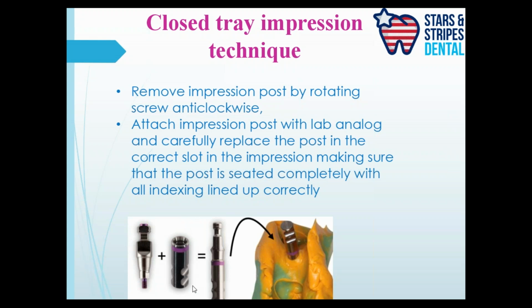Now, as the name suggests, why? First of all, understand what is implant analog. It is also known as implant replica. That means the implant you have placed in the patient's mouth, the same implant, an exact copy of that same implant, the Xerox copy of the same implant, is called implant analog or replica. Why do you need that?